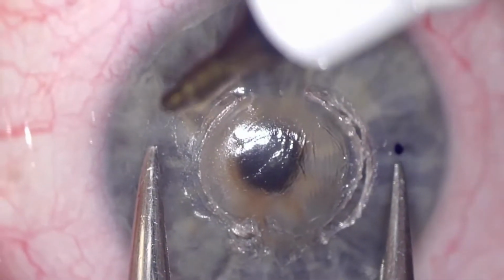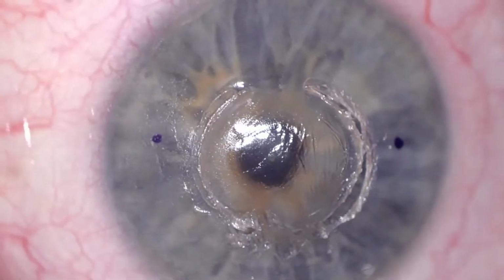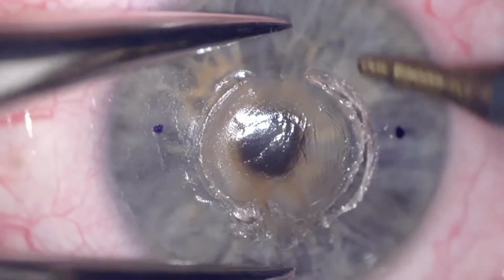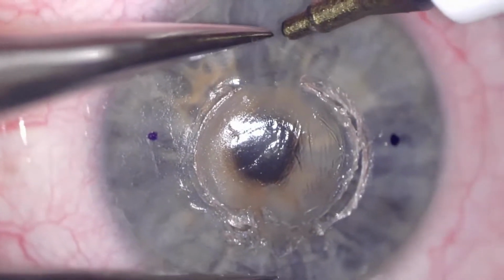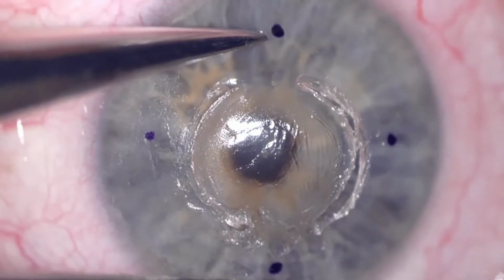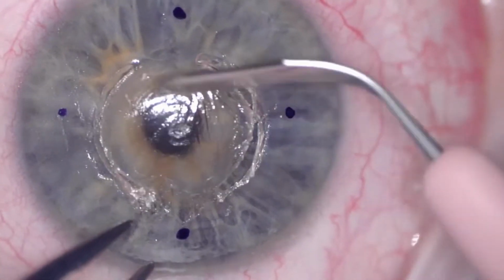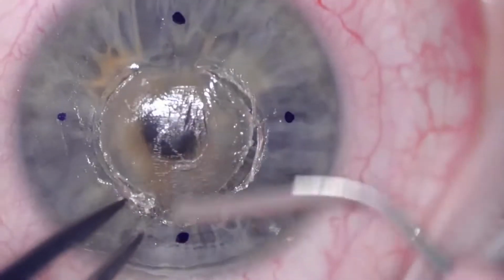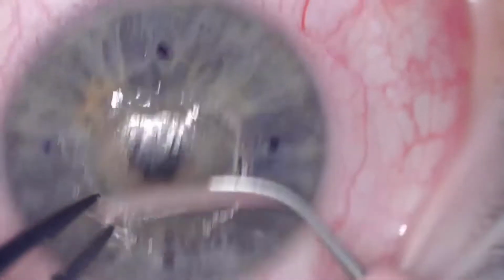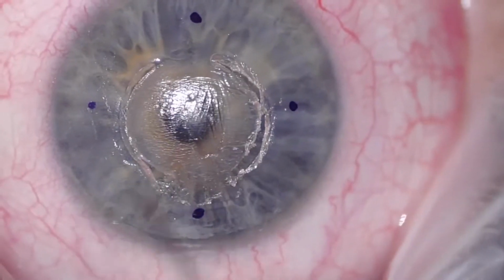Sometimes these can be a bit fiddly, so it's best to remove it as efficiently and quickly as possible. Here I'm marking my trephination points. You want to go beyond the part of the intrastromal rings, and you want to make sure you cover the majority of the diseased, keratoconic cornea. Here I'm just using an ink pen to mark the trephination size. I'm using a crescent blade to remove the irregular epithelium on the surface of the central cornea, just to make my view a bit better for later on.